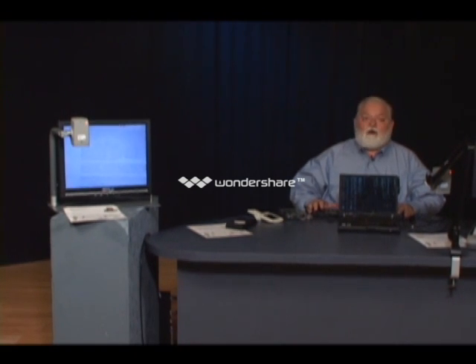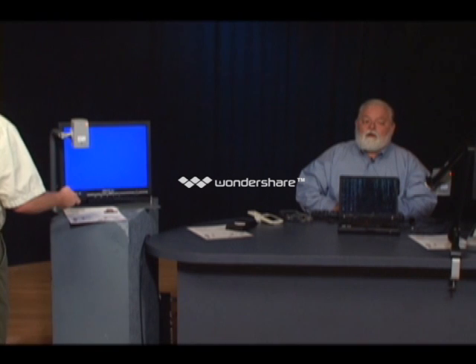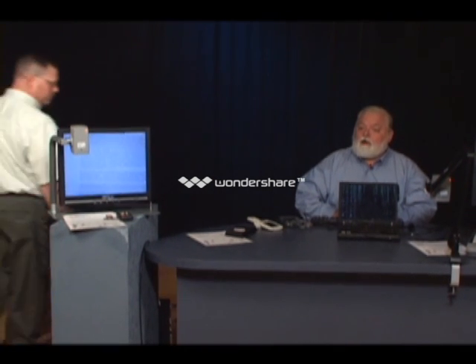Now, I want to show you a couple of other things quickly, then I'll go to my computer. There's a couple of small ones here. I'm going to have Neil just hold these up. You can see these. Grab the Lookie first. The Lookie is actually not made by Freedom Scientific. I thought I'd show you one that isn't. It is a little tiny portable pocket-size handheld unit.